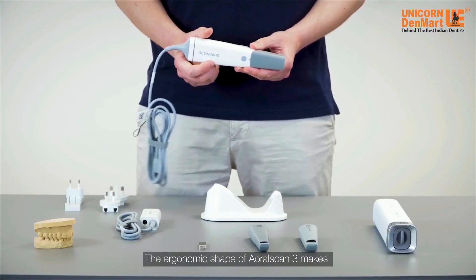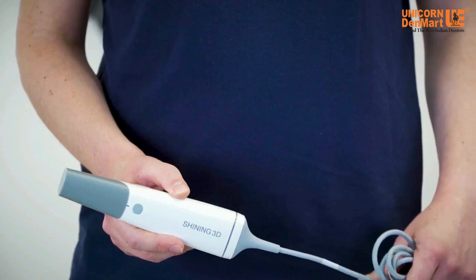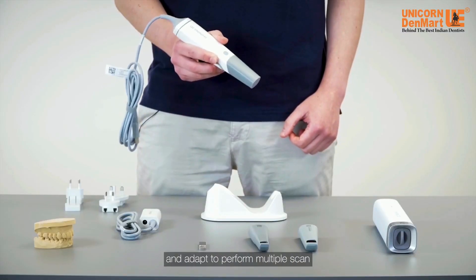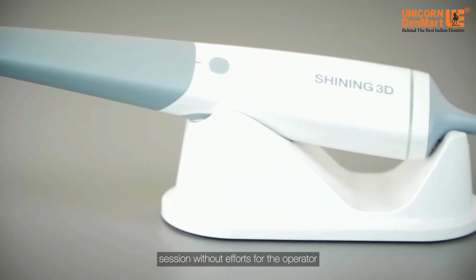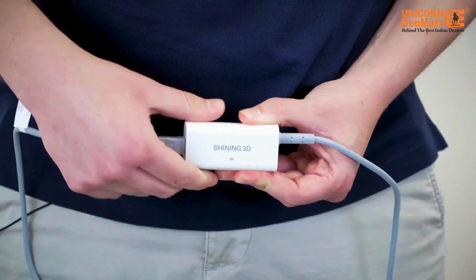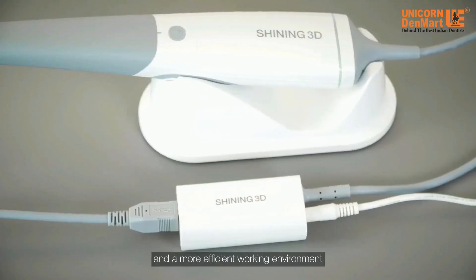The ergonomic shape of Aoralscan 3 makes the handle very comfortable and manageable. The weight of 240 grams only makes it truly handy and adapted to perform multiple scan sessions without effort for the operator. Also, the single cable connecting the scanner to the hub will help dentists to have a tidier and more efficient working environment.